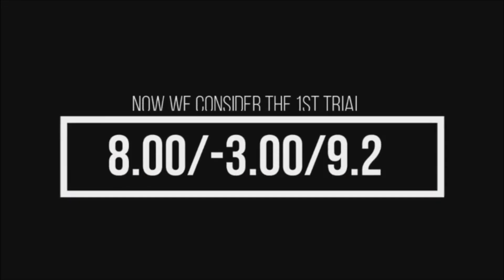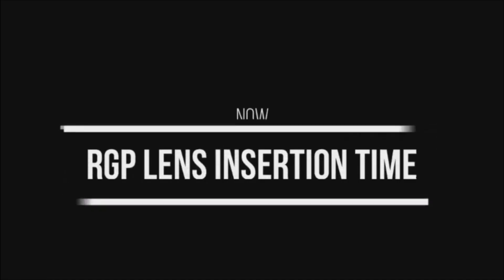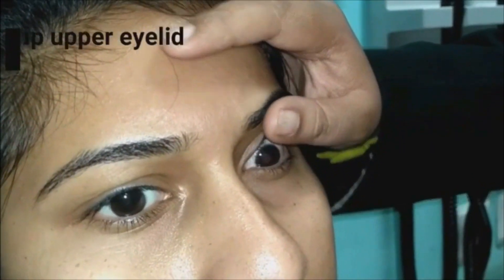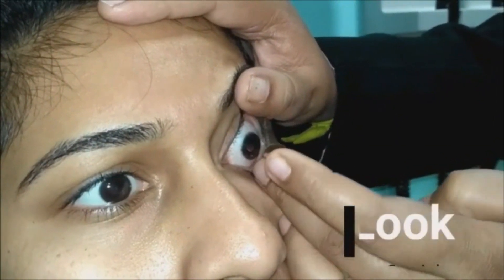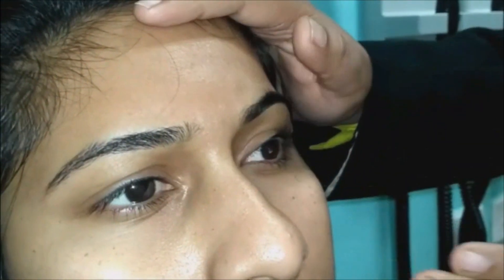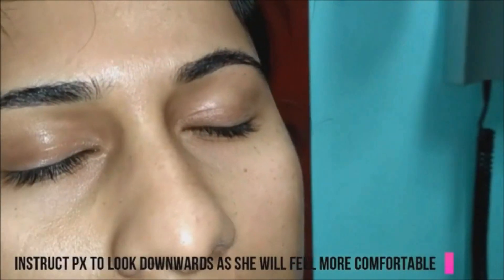Considering our previous parameters, the first lens trial is selected. Now the steps for RGP lens insertion: first lift the upper right lid with the thumb of the contralateral hand, then retract the lower right lid with the middle finger of the hand holding the lens. Ask the patient to look straight, and move the lens towards the cornea until contact is made.